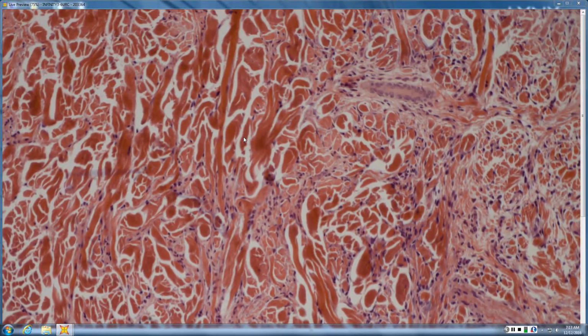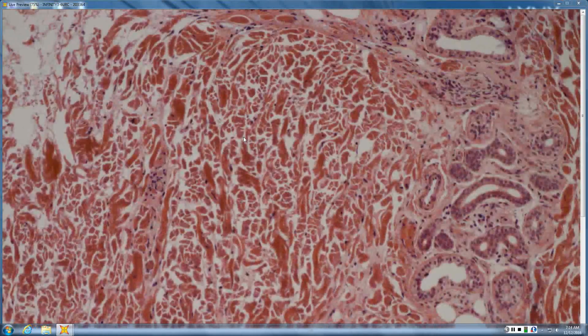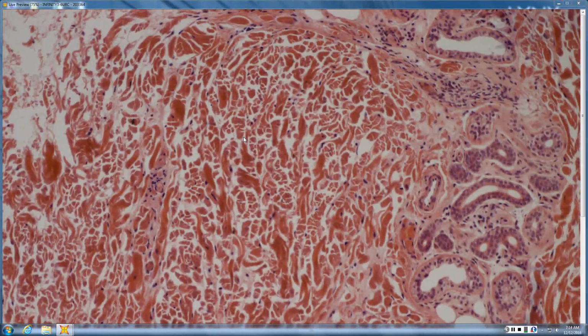What would be your biggest differential in this? Nephrogenic systemic fibrosis. You need history to tell you, because histologically they pretty much look the same. So you have to go with history. On your test, it would be really mean of them to not give you any history and to stick both of them in the answer choices. Even though it's not the best down here in this biopsy, there still are too many interstitial cells compared to some of the other ones.